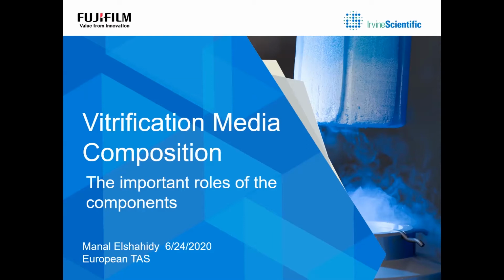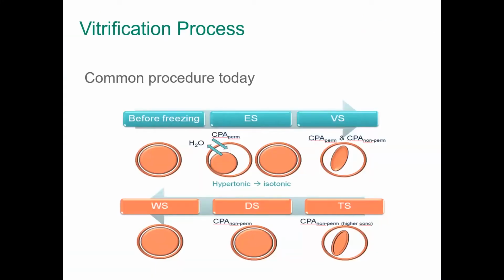So we'll start talking about the vitrification, but we're going to talk specifically about one factor that is affecting the vitrification process. We know vitrification has become a routine practice in every lab. This is worldwide now, and we know that the technique depends on many factors.